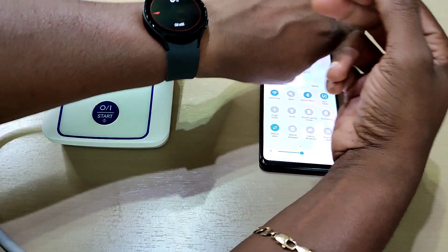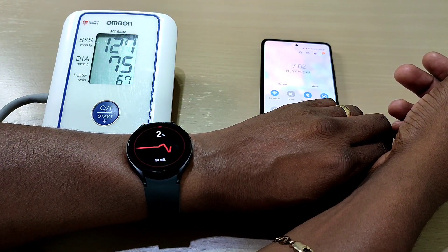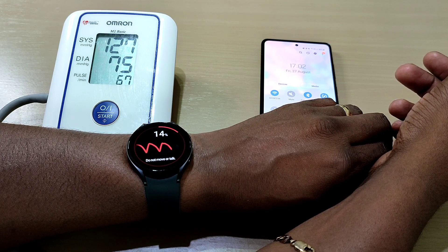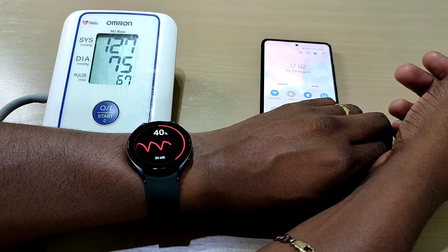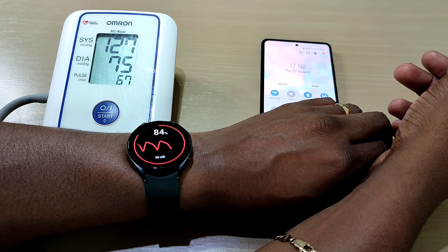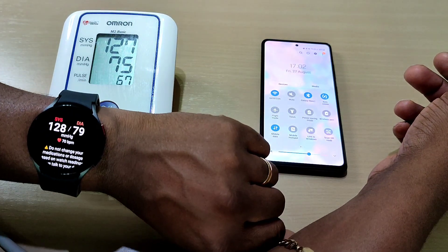The watch is reading 127. Then the cuff reads 127 as well. Then the watch reads 128 — that's close enough, that's very close. I should have had the cuff on to do it straight away, but the readings are aligning well.